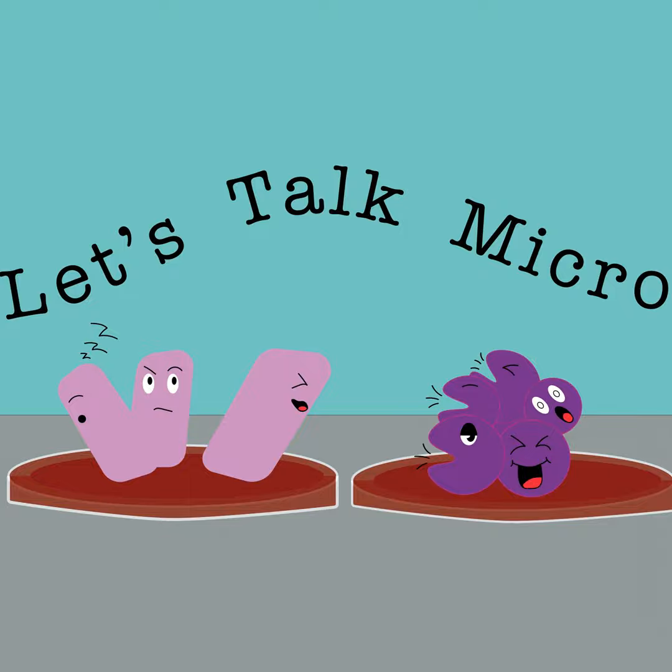In other areas, like the core lab, you have your SOPs and you follow that procedure. And with micro, we have our procedures for different cultures. But if the source is one where this pathogen could be present, and that typical culture setup doesn't have that agar, then you go ahead and add it, just to make sure that you give that organism an optimal chance to grow. Like I said, a genital source has many bacteria. So by throwing in that Martin Lewis or that MTM, you're giving that organism not only a chance, but you are also successfully ruling it out. And that way you don't miss it.